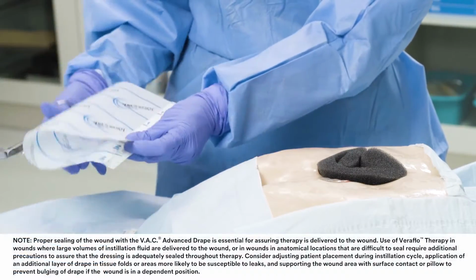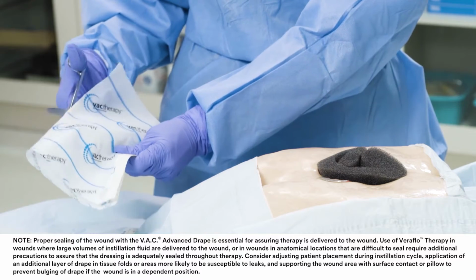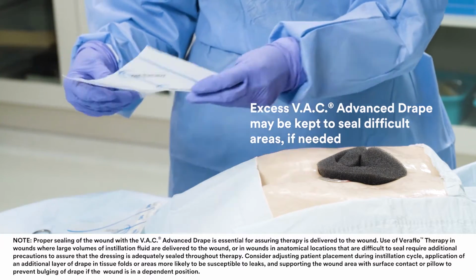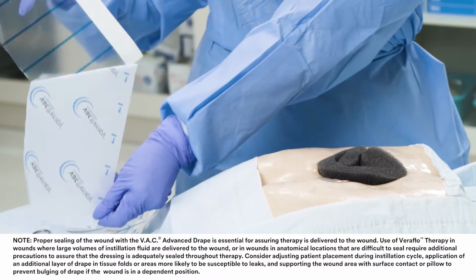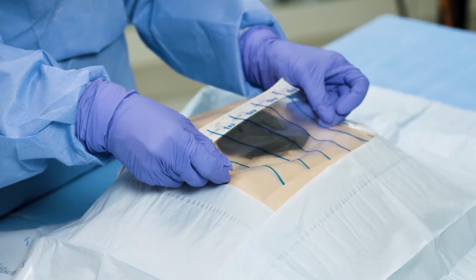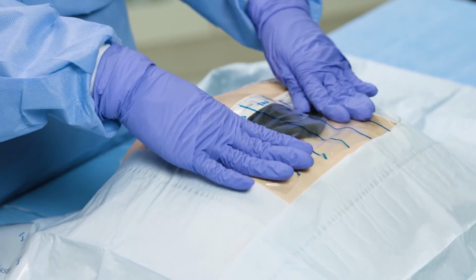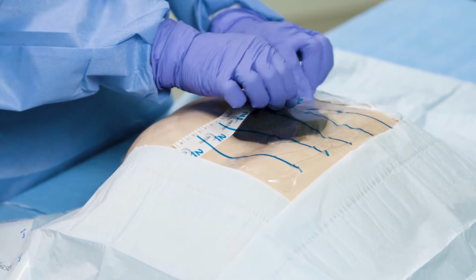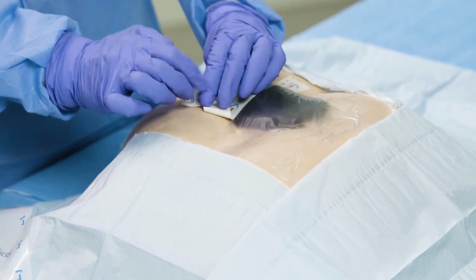Trim the V.A.C Advanced Drape to cover the foam and an additional 3 to 5 cm border of intact peri-wound tissue. The V.A.C Advanced Drape may be cut into multiple pieces for easier handling. Carefully remove layer 1 to expose adhesive. Place the adhesive face down over the foam and apply the drape to cover the foam and intact skin, ensuring at least a 3 to 5 cm border of intact peri-wound tissue. Remove layer 2 and pat the drape to ensure an occlusive seal. Remove the ruler handling bars.